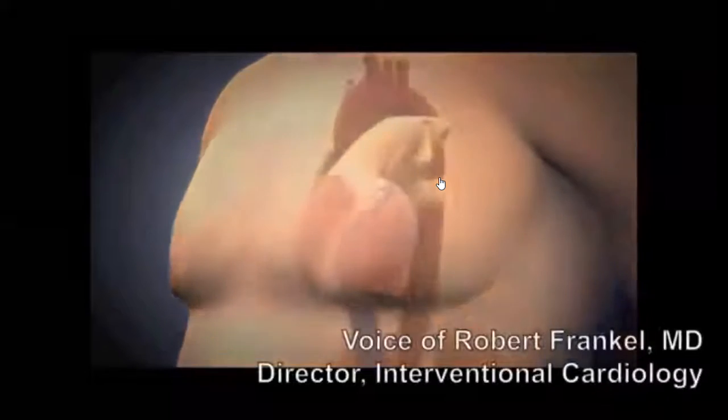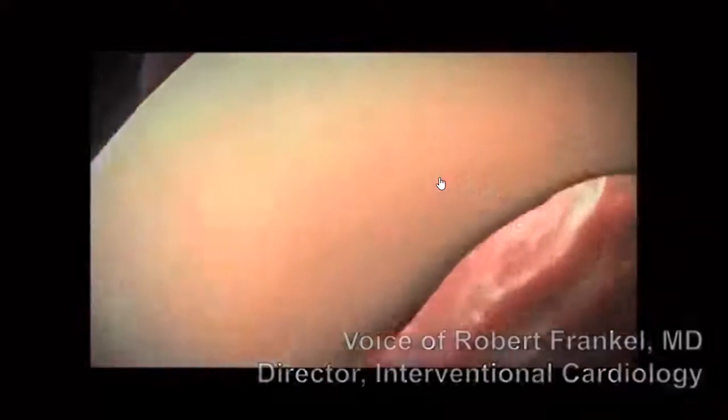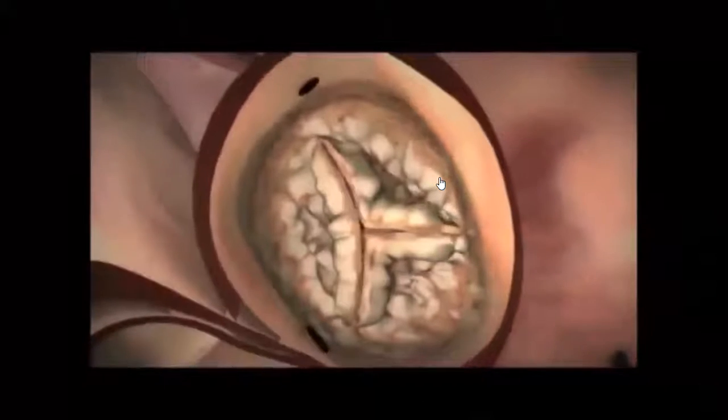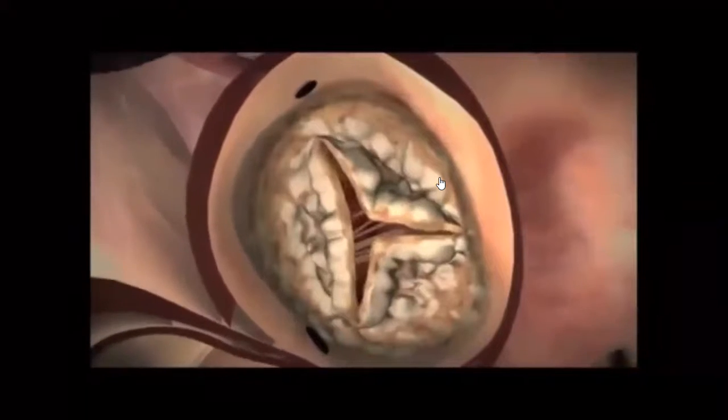The transcatheter aortic valve replacement procedure is performed on patients who have severe calcified aortic stenosis. And here you see an aortic valve that's not opening well. It's severely calcified and the leaflet motion is restricted.